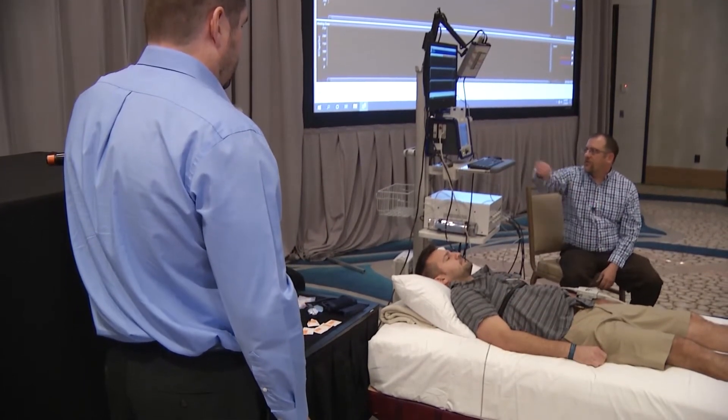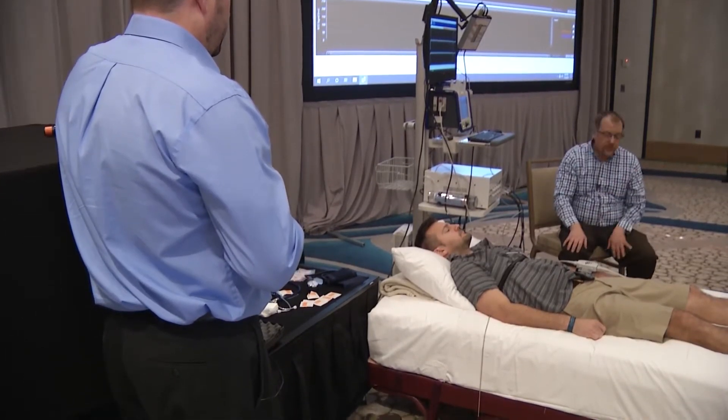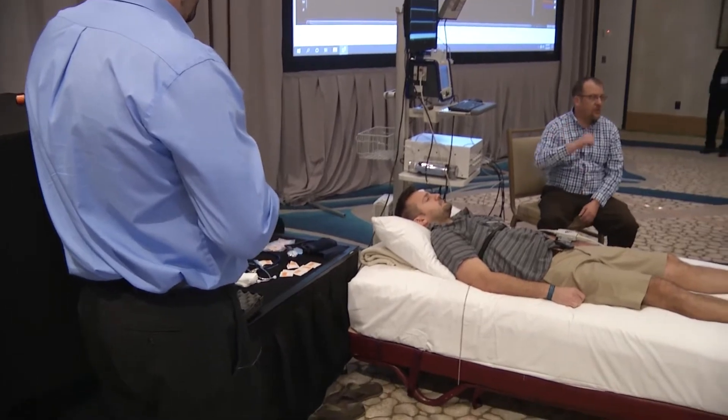We're now picking up the arterial pressure coming from the finger. Next, we'll get an upper arm inflation cuff going, and once that's done we'll be able to start the test.